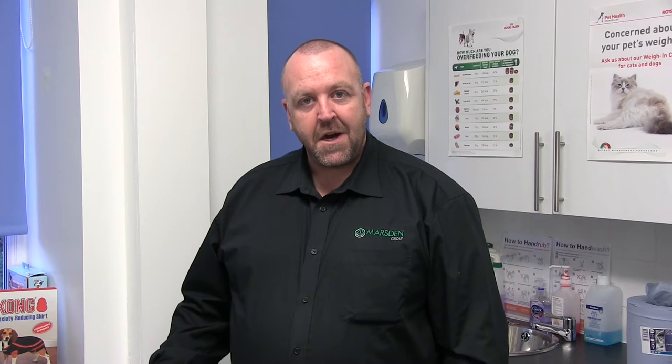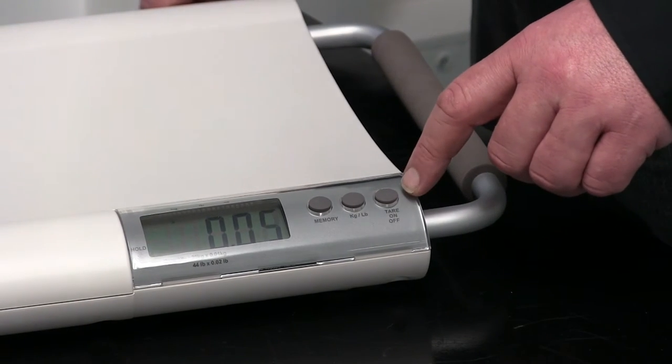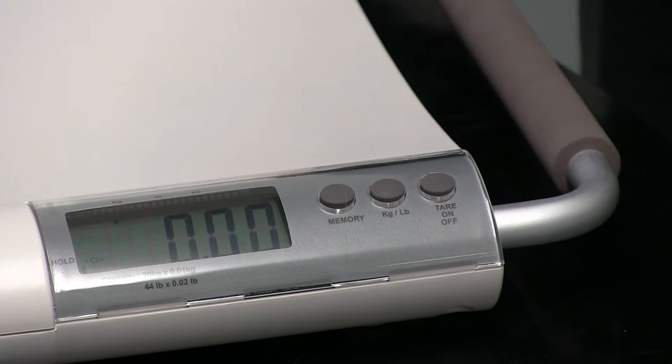So with the help of our friend Cheery, we're going to show you how the V20 works. Ensuring the scale is switched on by pressing the on button here. Once the scale shows a line of zeros, you're ready to place Cheery on the scale.